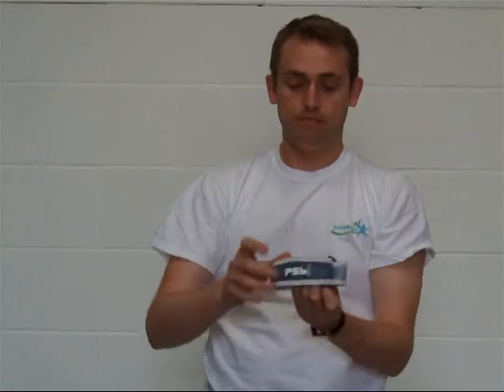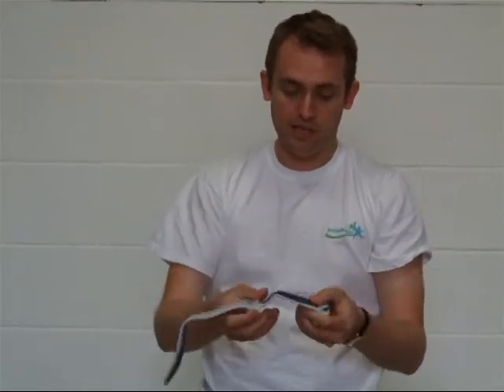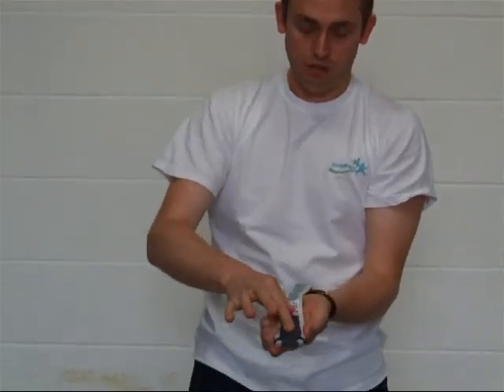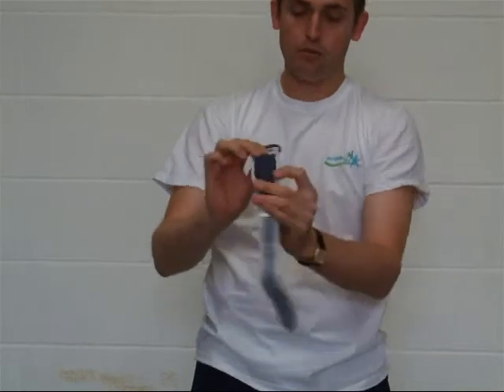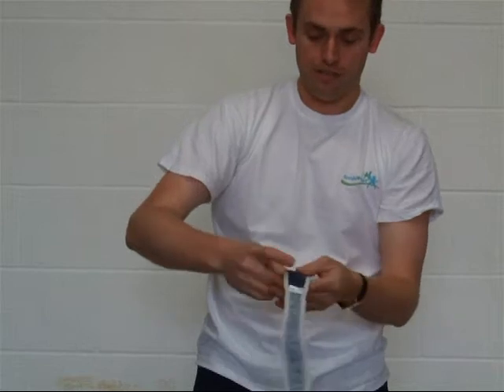It's a small brace. On the inside of the PSB are rubber dimples to stop it sliding, and also a padded section where it sits on the tendon.